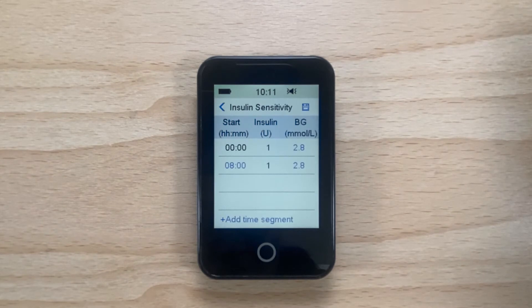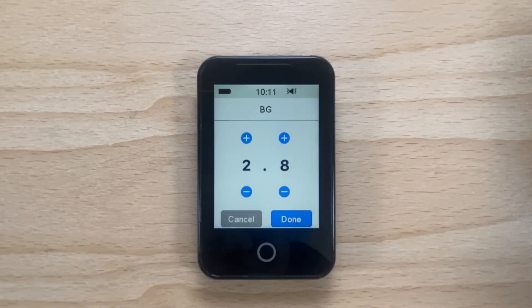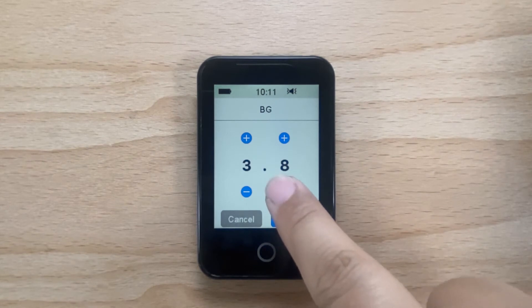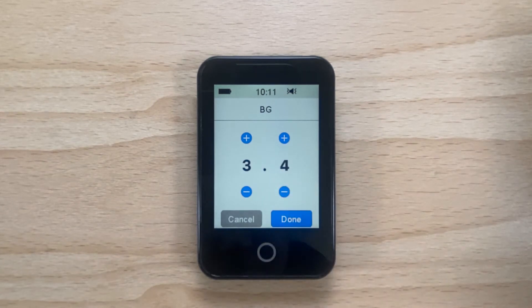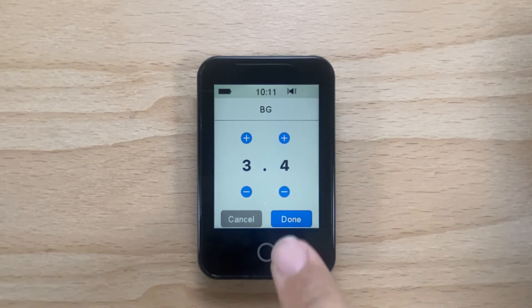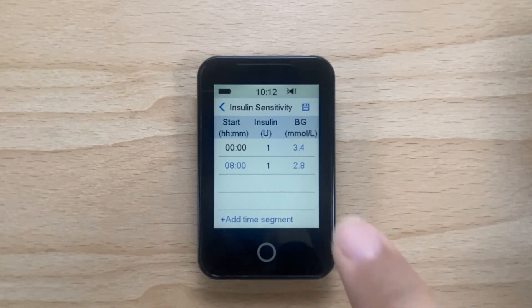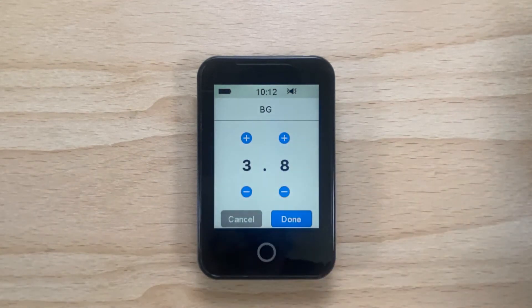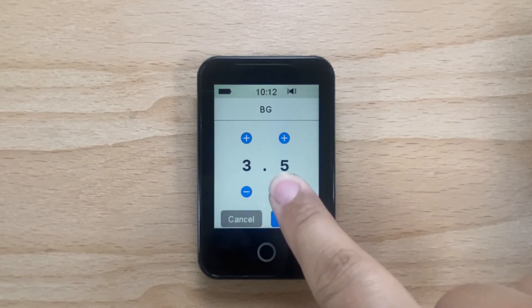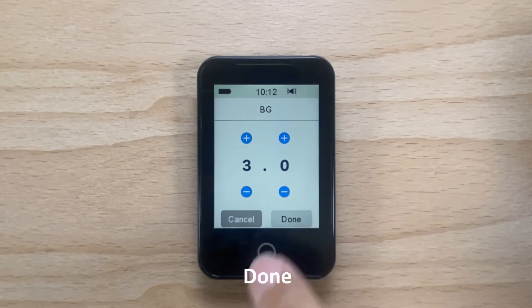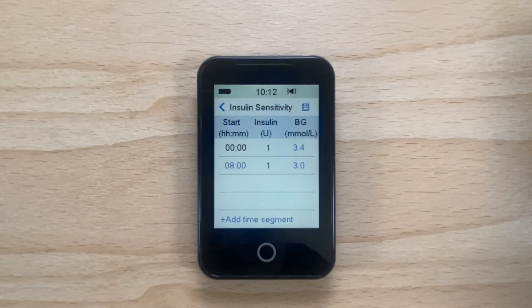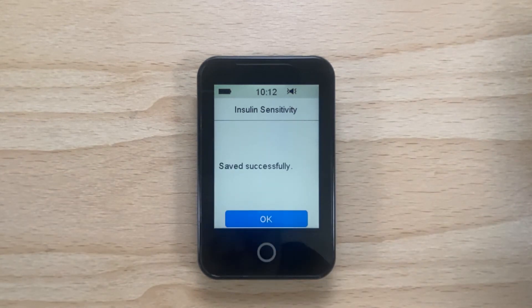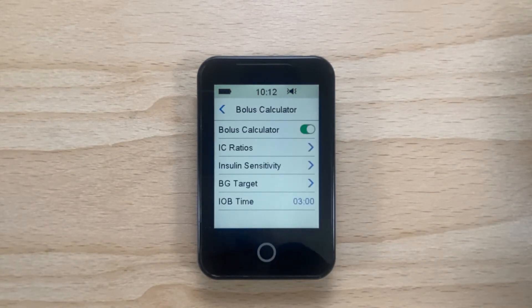You can adjust the insulin sensitivity for each time segment by tapping on the blue number next to each time segment. Now tap Done. Once you have completed this, tap the save icon in the top right hand corner of the PDM to save your insulin sensitivity.